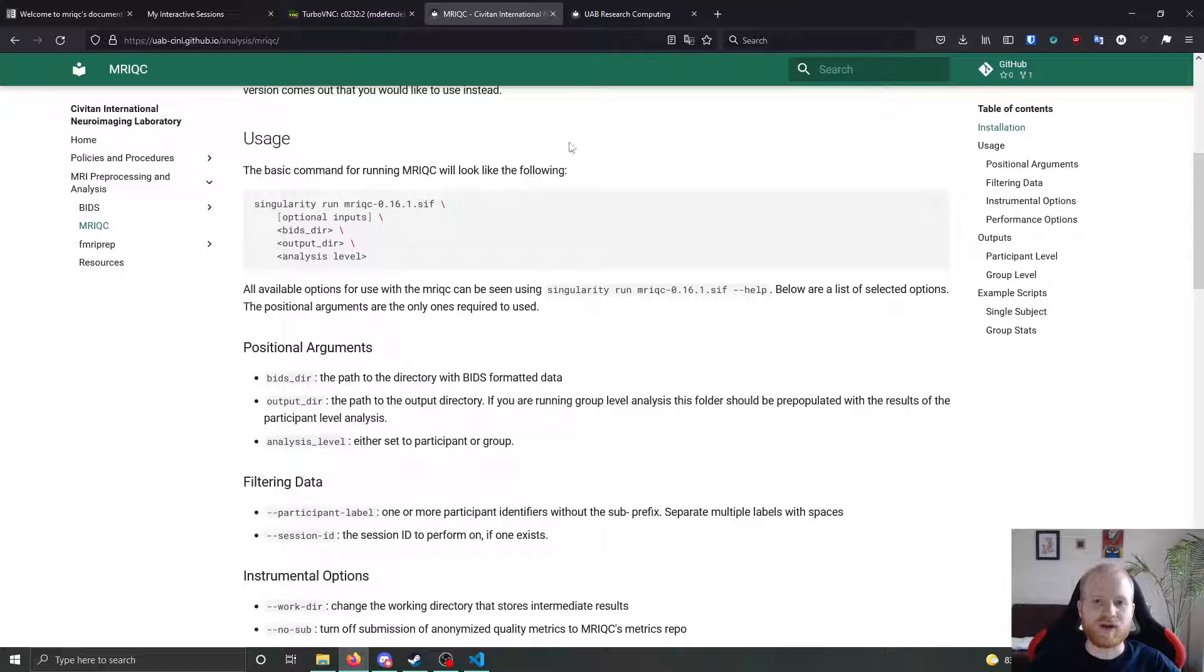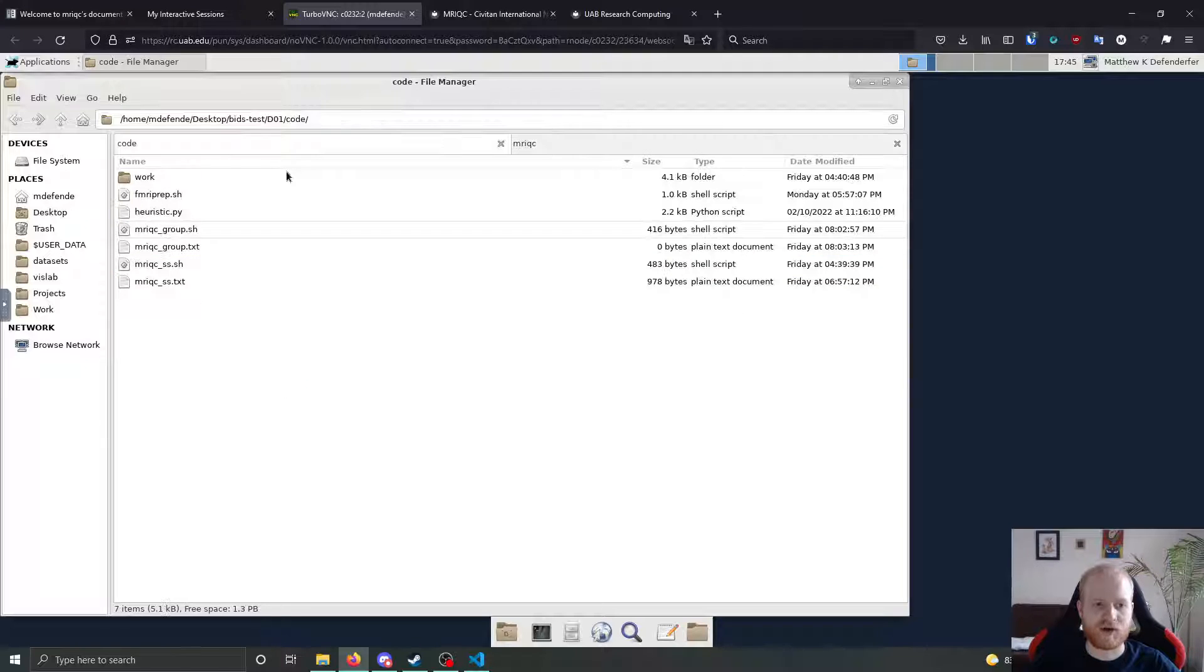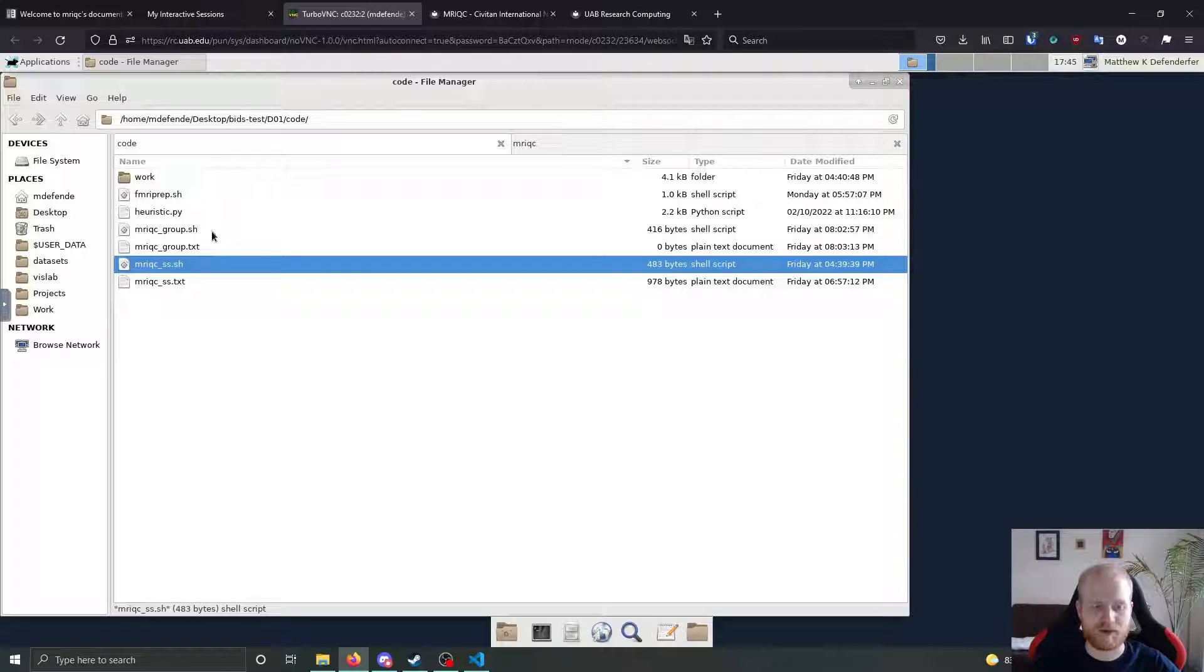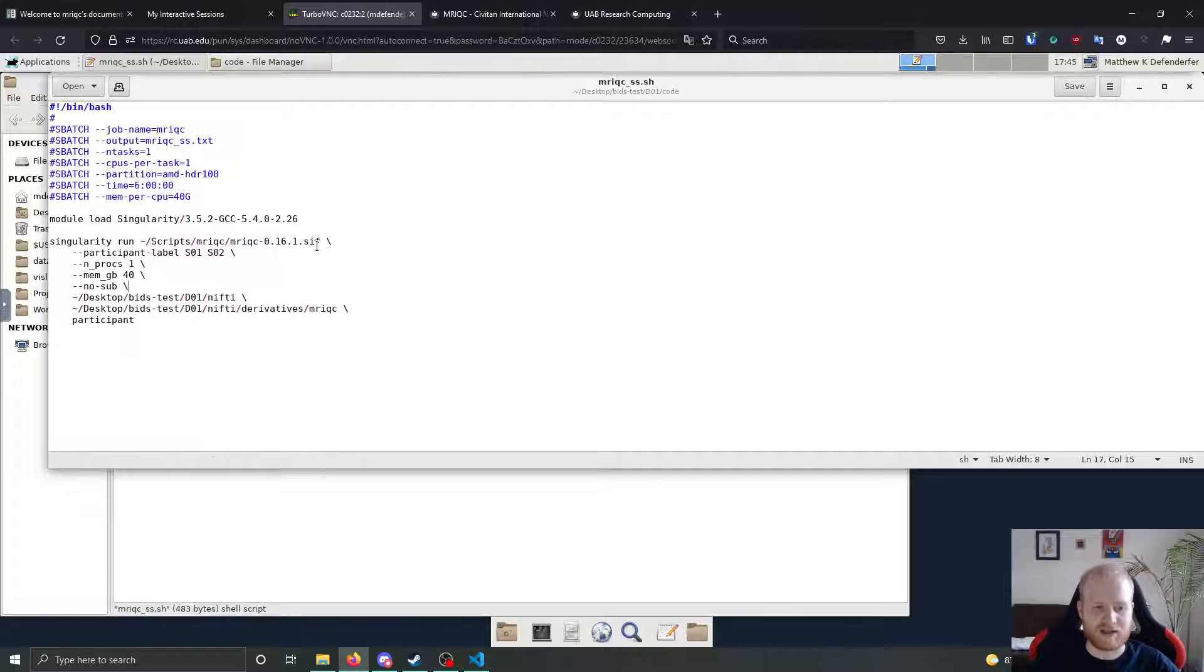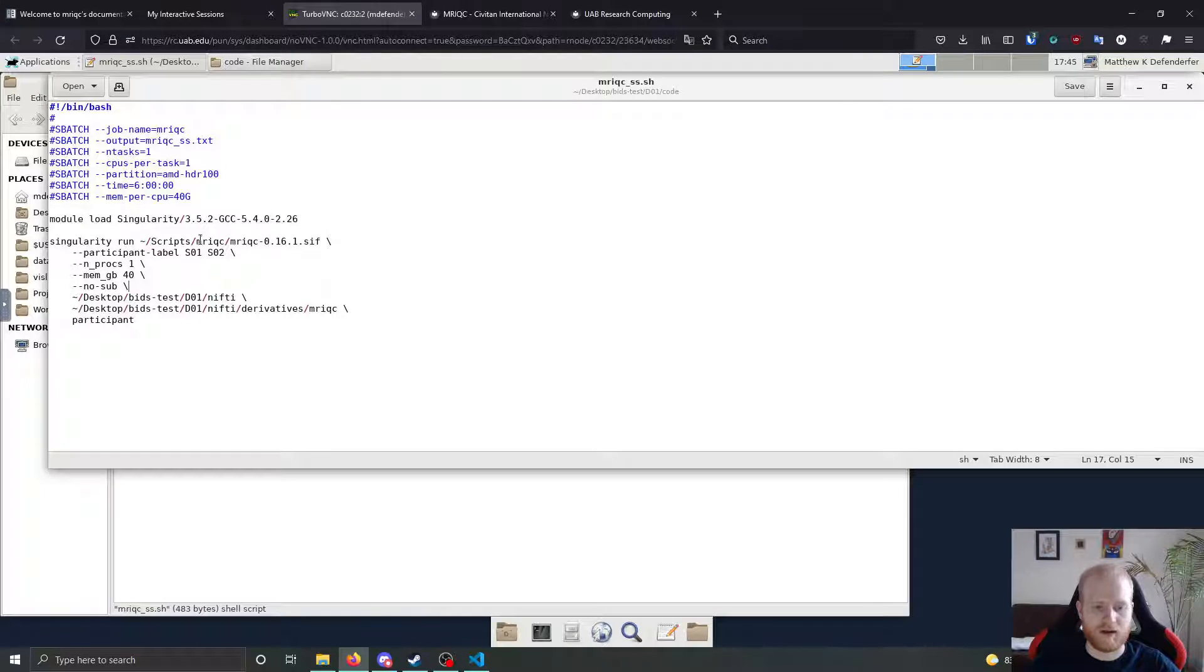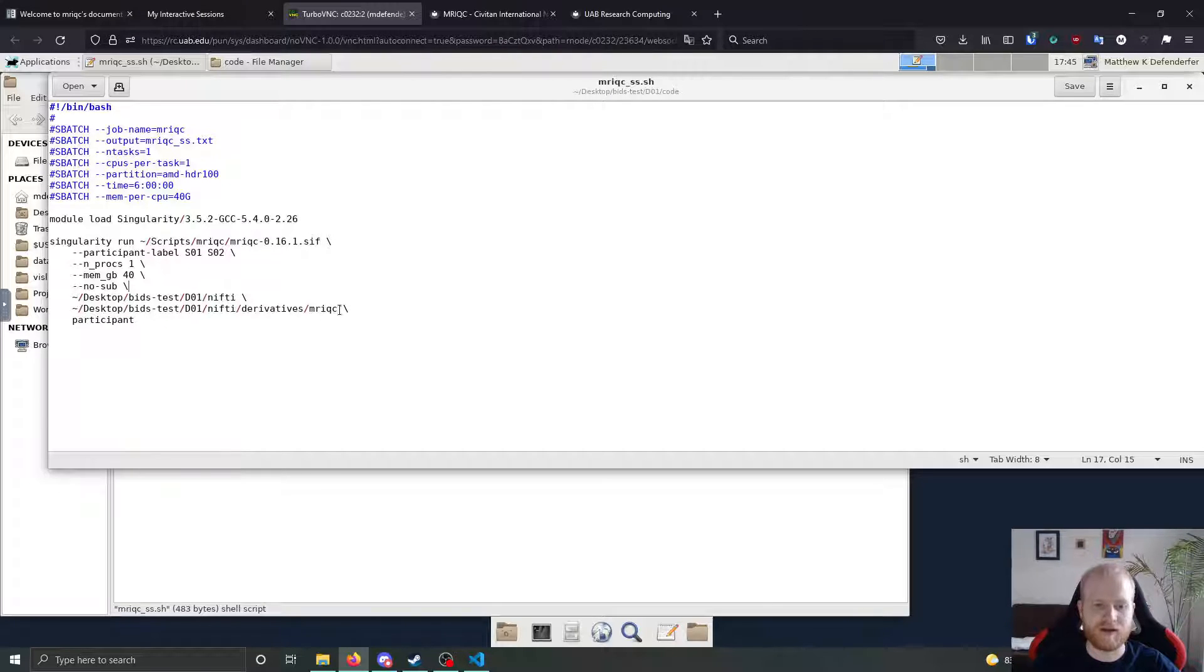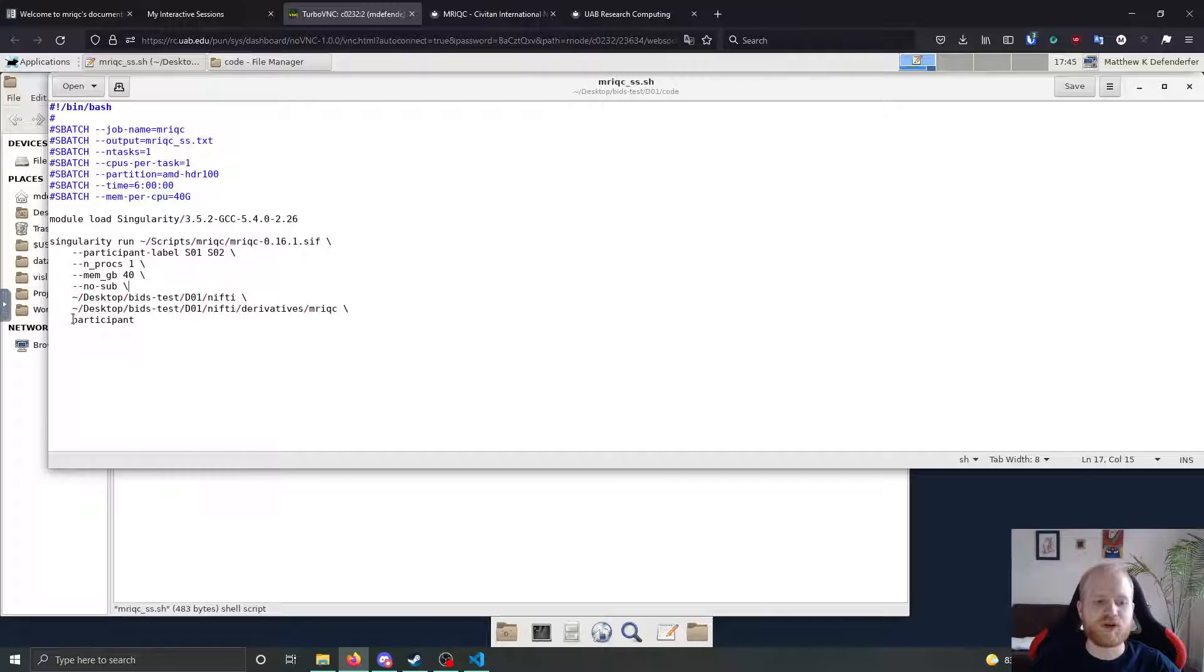So if we look at an actual script that I've run previously, I've got an MRI QC single subject script and a group script. So let's look at the single subject script. We've got that basic command, the path to the bids formatted directory, and then the path to the output directory. In our case, I'm putting it in the derivatives slash MRI QC directory here. And then we're doing it at a single participant level at a single subject level.